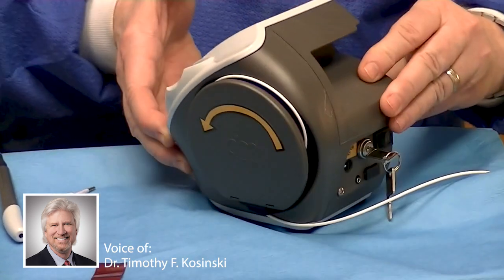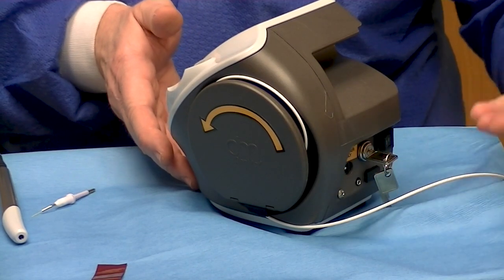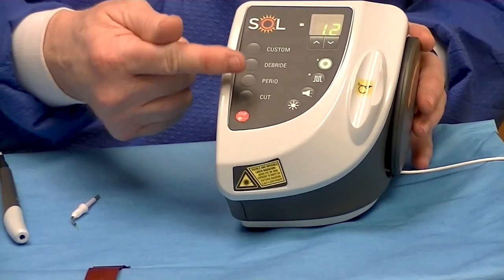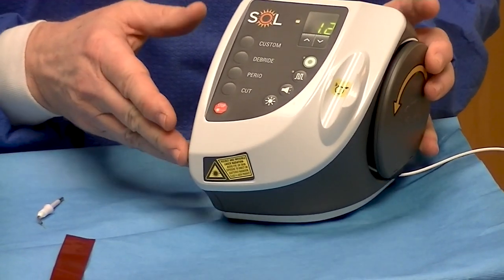If you look on the back here, there's a key and then there's a charge area where we can charge it during the course of the day. If you turn the key, you'll see that the light went on. Now it is in a standby position.